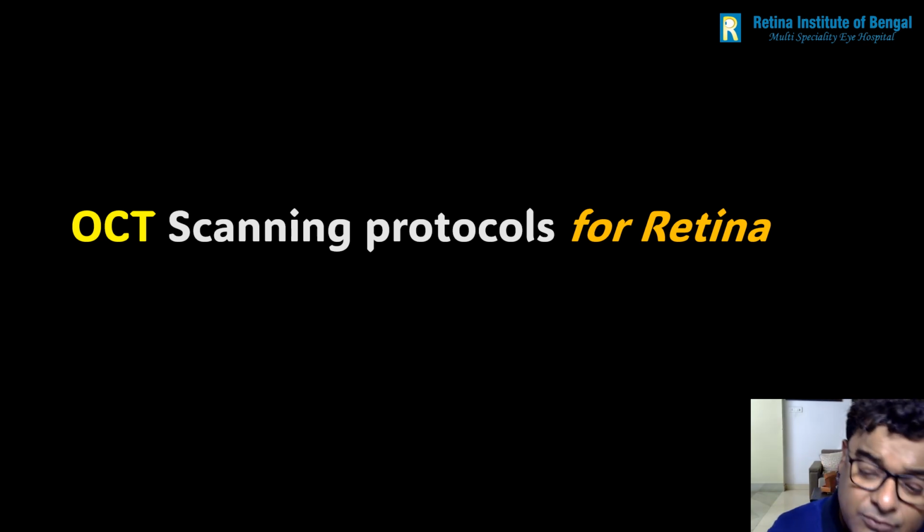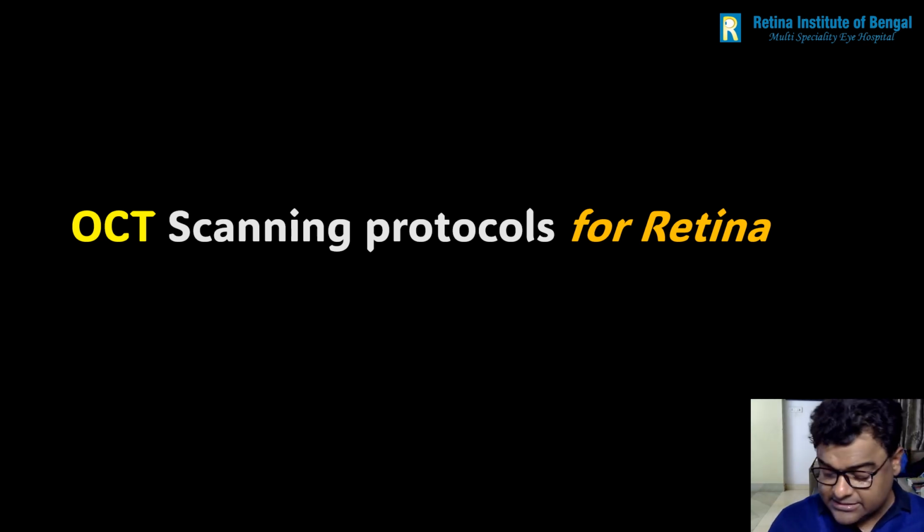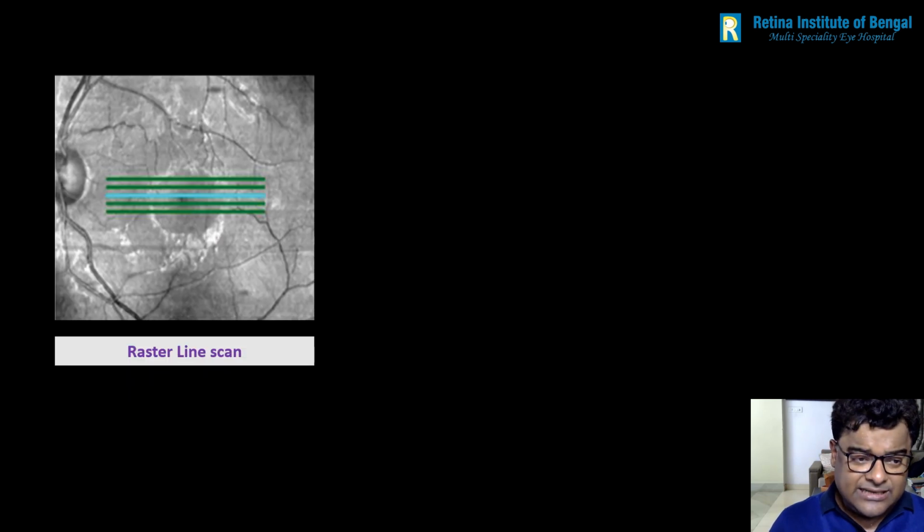So what are the scanning protocols for retina using an OCT? You can just scan a particular area of interest by doing a few line scans there. Now this scanning of putting these lines one adjacent to the other is what we call the raster scanning protocol. So here you are just scanning a particular area that you are interested in.